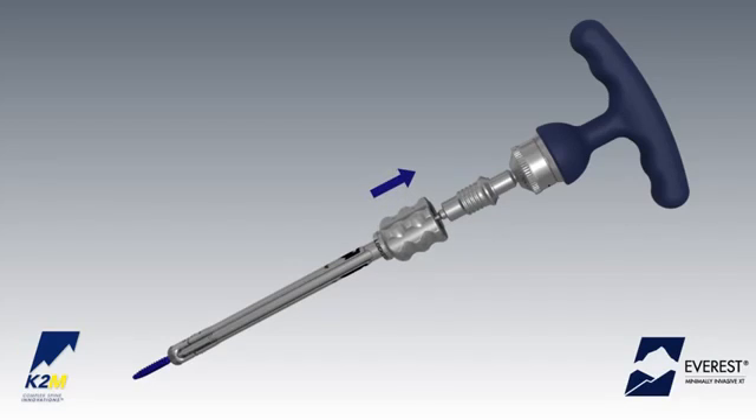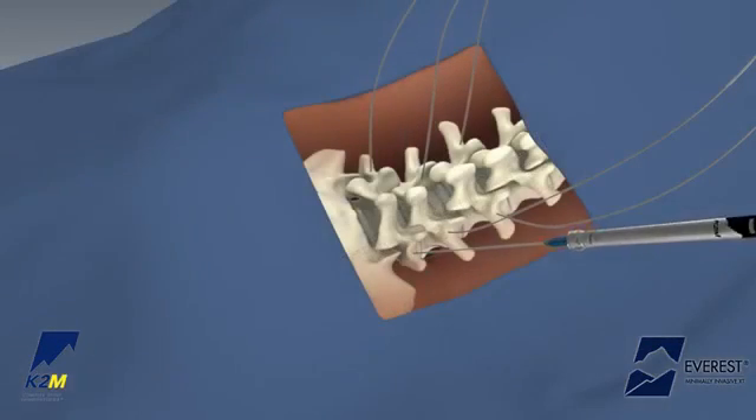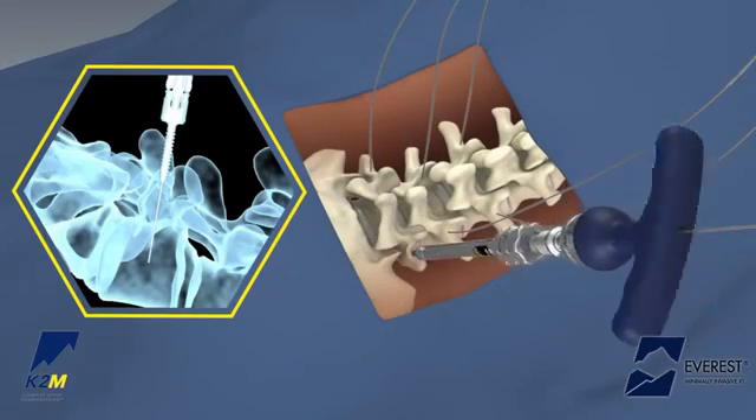Second, pull up on the thumb knob of the Everest MIXT screw inserter to lock in engagement. Advance the Everest MIXT screw inserter over the guide wire.